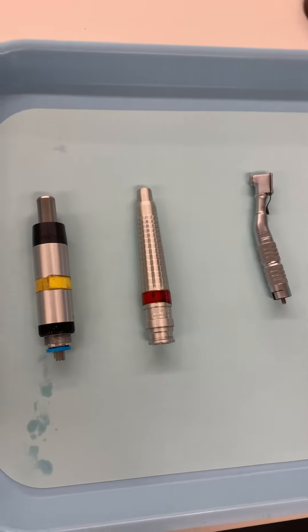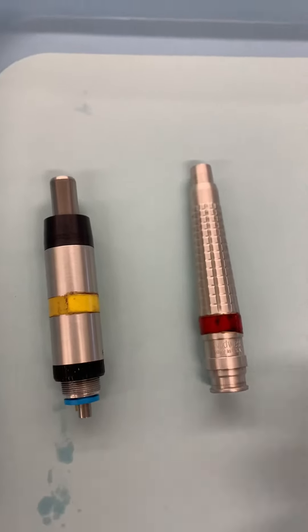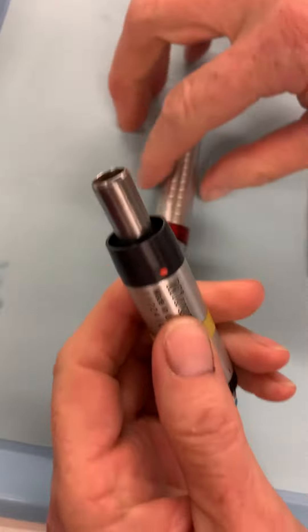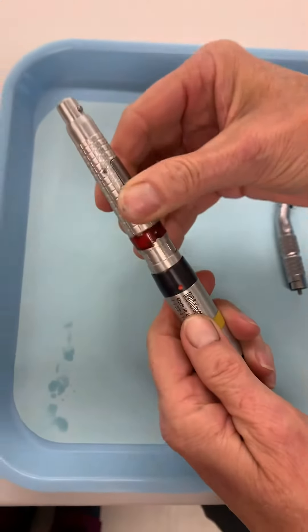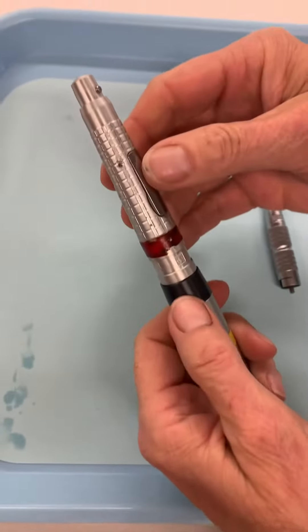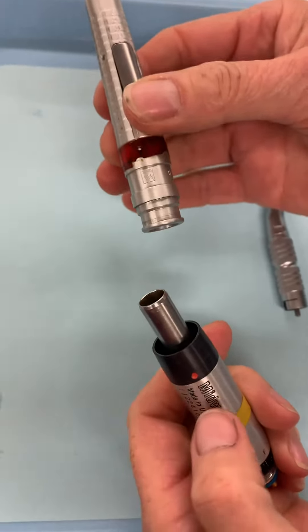Let's talk about how to set up the handpiece. On the slow speed motor, we're going to put the straight cone or the nose cone on the motor — it's just going to slip right on top and click down in there. Always check to make sure they're on. To remove from the slow speed motor, we're going to push this red button right here and pull it up.